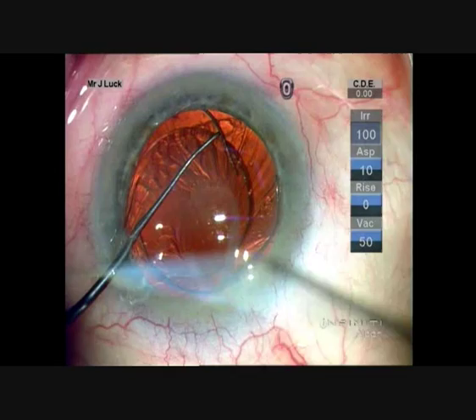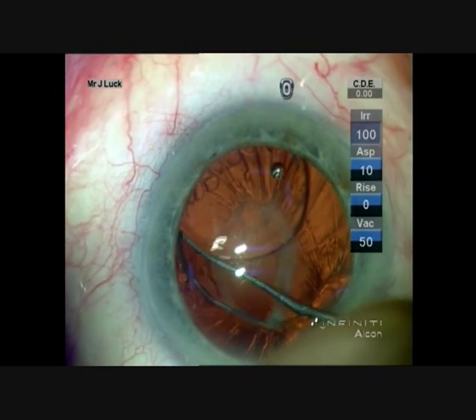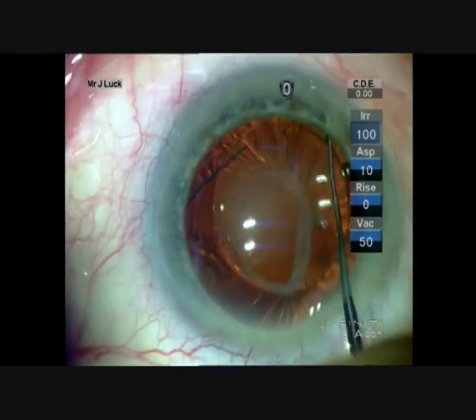You can see here we're just slightly stuck in the optic-haptic junction. A quick flick releases the lens, and the lens then dials out quite nicely into the ciliary sulcus and settles down and centres quite nicely at the end of the case.